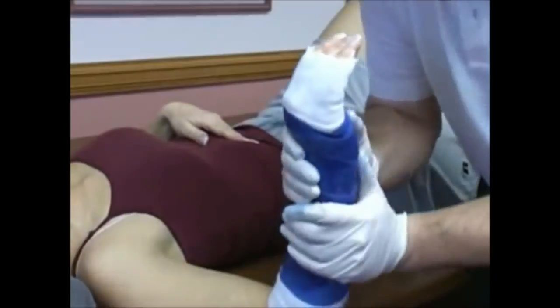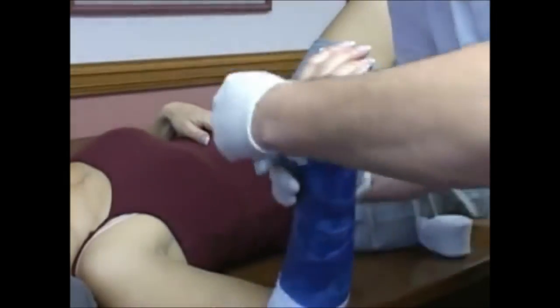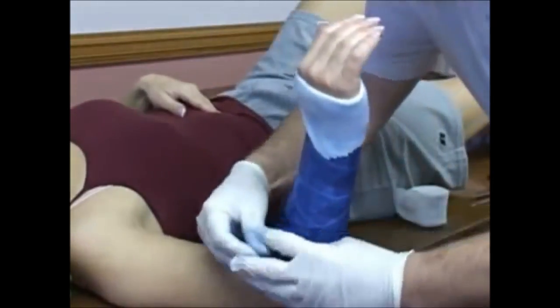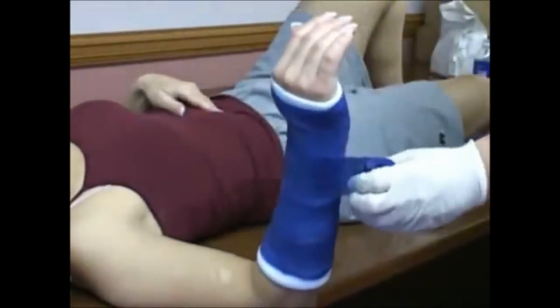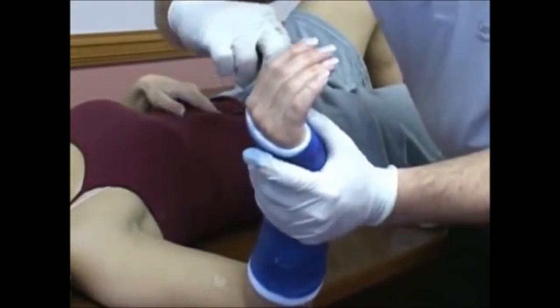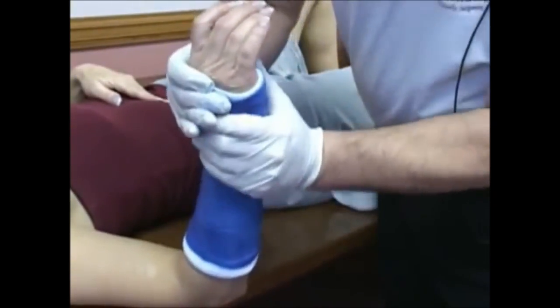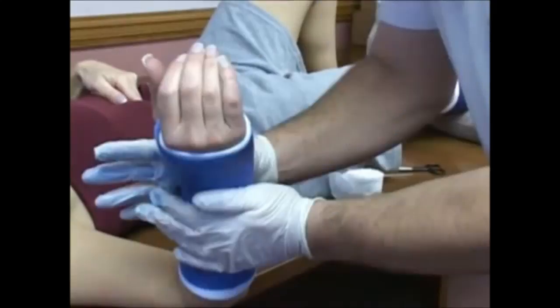Move it in with a little extra water. Check the alignment once again. Bring down the edge of the stockinette, distally and proximally. Another roll — start proximally and just finish off the cast. Now checking that web space area, you want to take that little edge of stockinette and fold it up on the cast while it's setting up, so you don't have it cutting in around the finger. Make sure your edge is tacked down, hold on to that edge up here around your thumb. By flattening out the surface of the cast, you limit a little bit of the motion of the forearm.